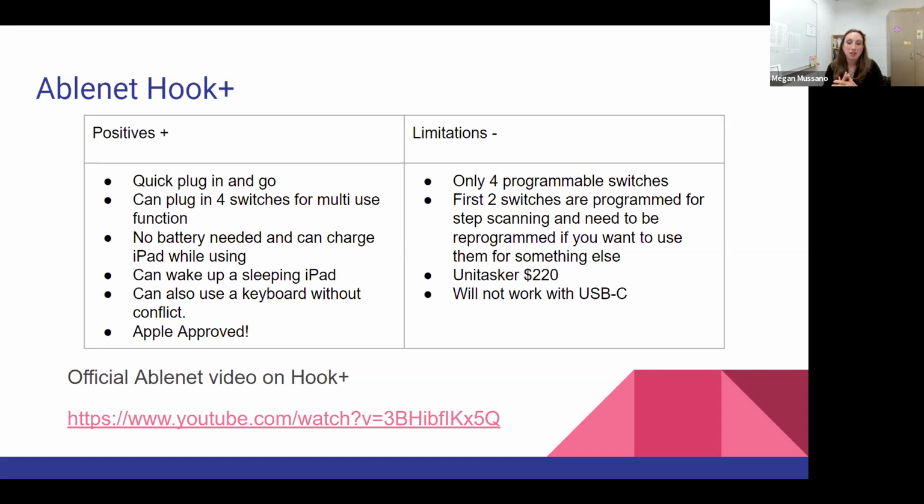I say this because it is only meant to plug into the iPad, where some of the other ones we're going to talk about aren't. It's about $220. And right now, the Hook Plus that I own has that lightning cable. So it will not work with the USB-C plug, which is what the new iPad Pros are using.